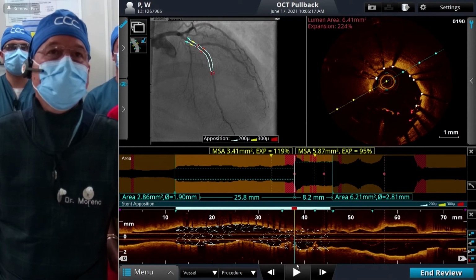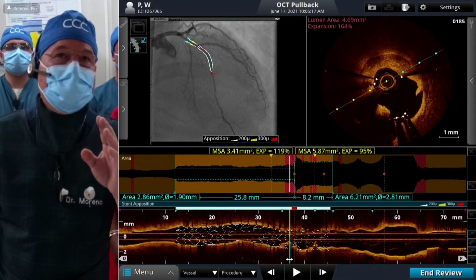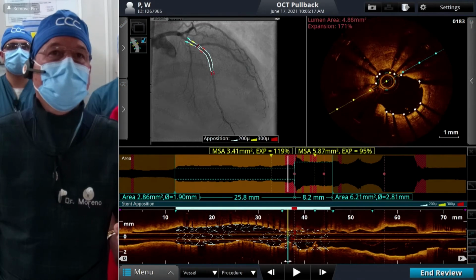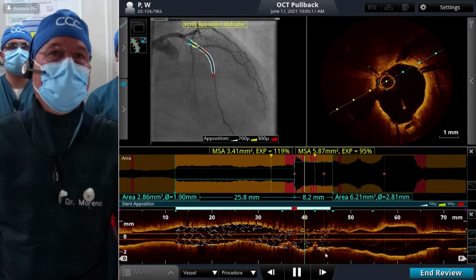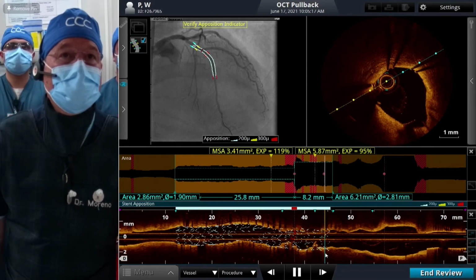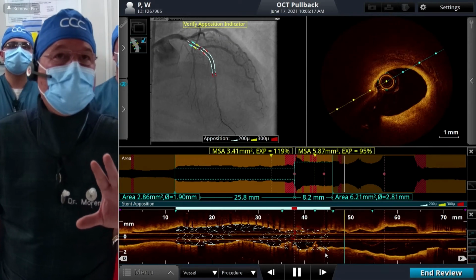Just keep coming back. And then we're interested in looking at the proximal segment. You have some plaque protrusion. There is a little dissection at 3. Coming back, we still see the double lumen. And now this is the proximal LAD, that is a much larger vessel. We're still in good, and this is the reference that we have a little dissection.